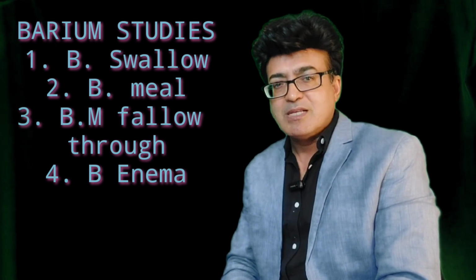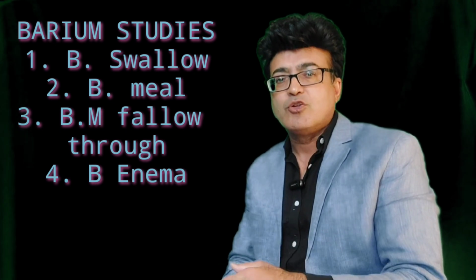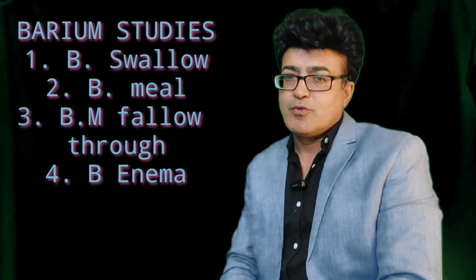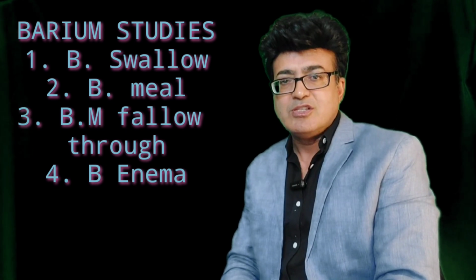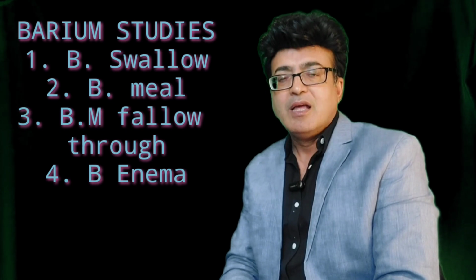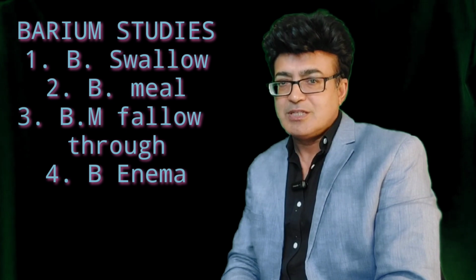As far as barium enema is concerned, if there are any polyps or tumors within the sigmoid colon or rectal area, or sometimes you need to look for changes of ulcerative colitis or Crohn's disease, you can depend on the barium enema. So barium studies are one of the integral investigations of the radiology department.